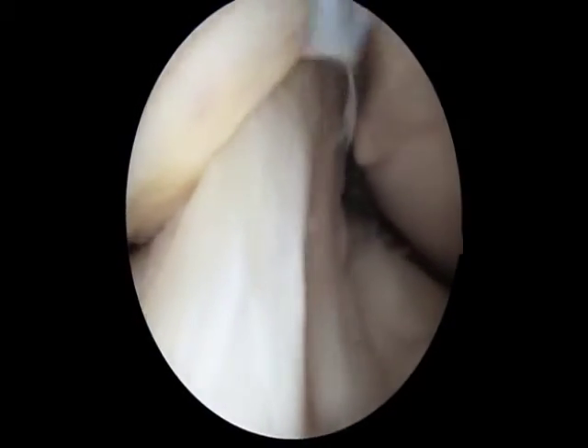Here we are looking at the anterior cruciate ligament and again this is probed to ensure that it is a rigid structure with no damage to it.